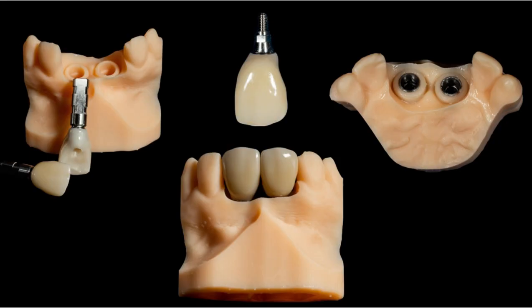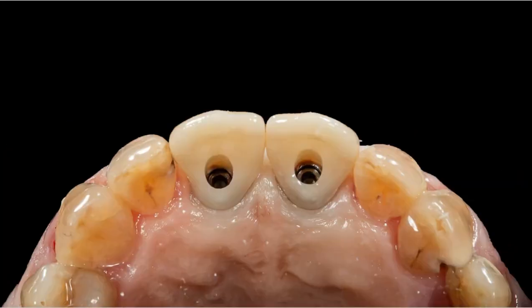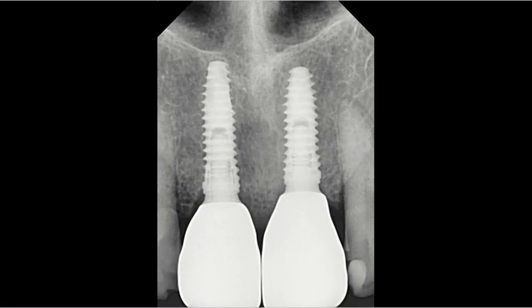Note the hex type is usually used in single restorations, of course, to avoid rotation of your final restoration. The final result is satisfying for your patient, just monolithic zirconia and extrinsic stains. No extra effort is needed, and your screw channels are emerging perfectly from the cingulum, resulting in perfect function and aesthetics of the restoration. Here is the X-ray, showing the parallel view between the implants and their final position, and look how the restorations are fully seated and the margins adapted well to the substructure.